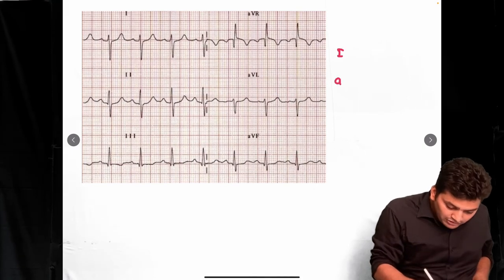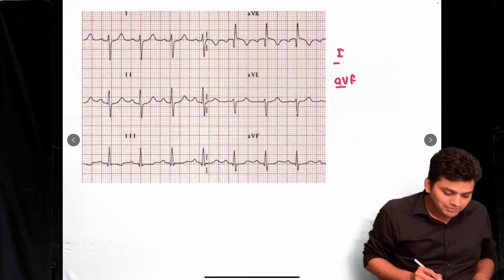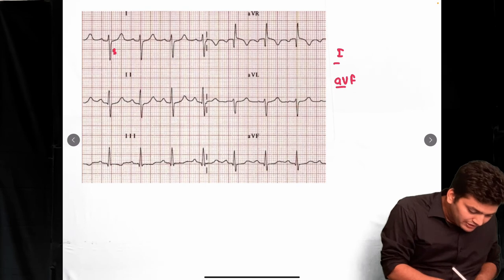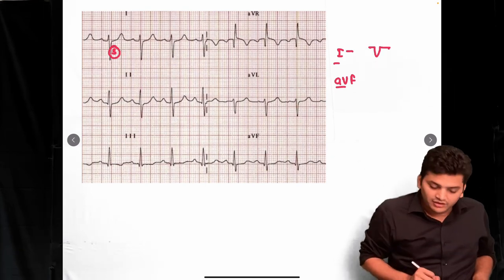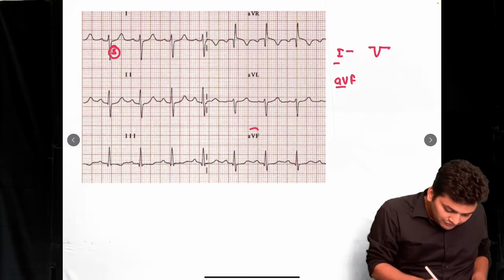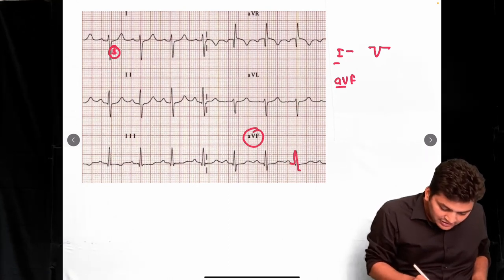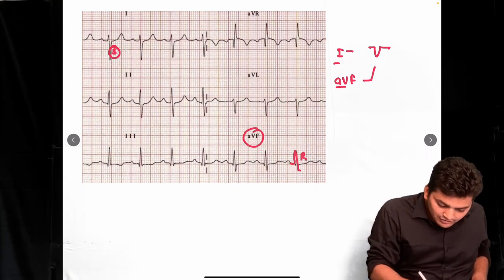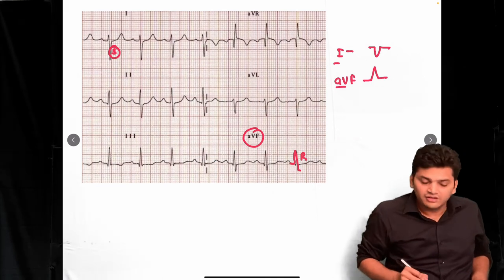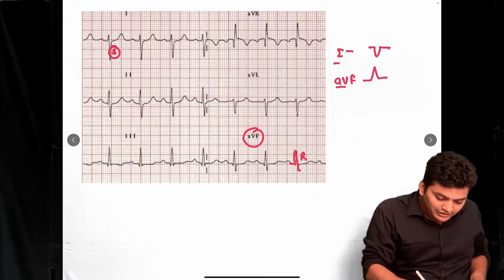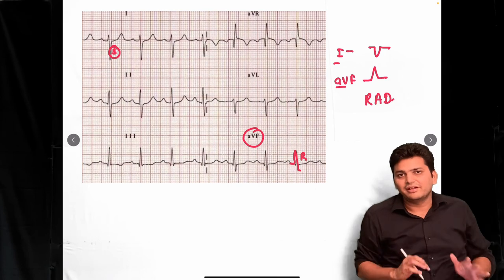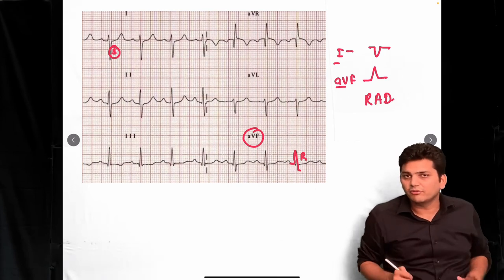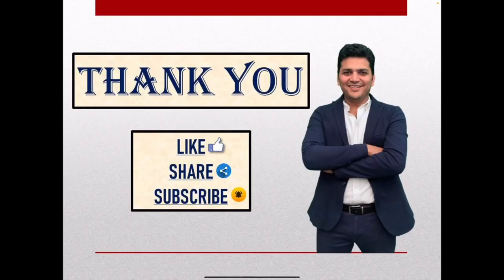In the next example, looking at Lead I, the S wave is bigger than the R wave, so Lead I is negative. In AVF, the R wave is bigger, so AVF is positive. They are approaching towards one another — this is right axis deviation. This is how you find out left axis, right axis, or normal axis.